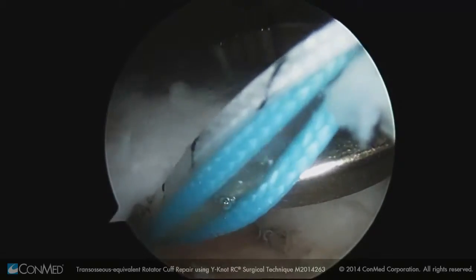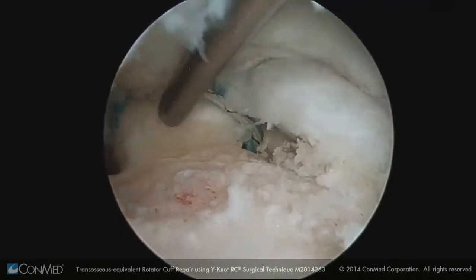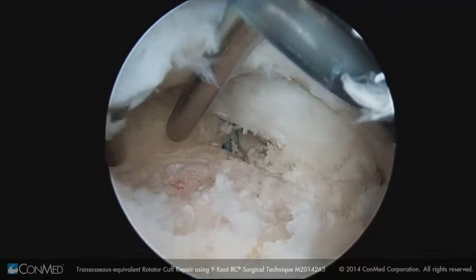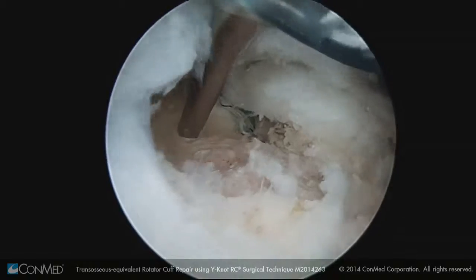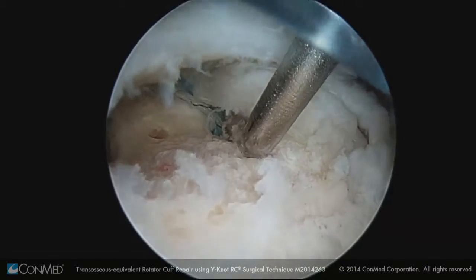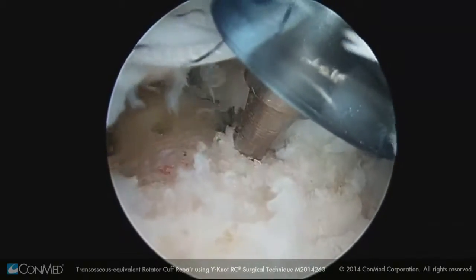And once again, we're going to select our sutures and pass them in mattress fashion. Here we're taking an additional step to attempt to stimulate marrow efflux from the cortex. We're simply taking a very fine awl and micro-fracturing the greater tuberosity in the region of the tear, generating our own PRP, if you will.